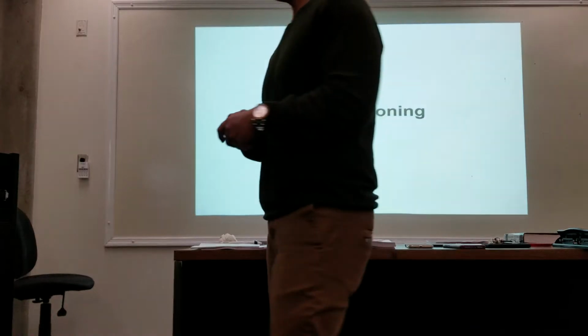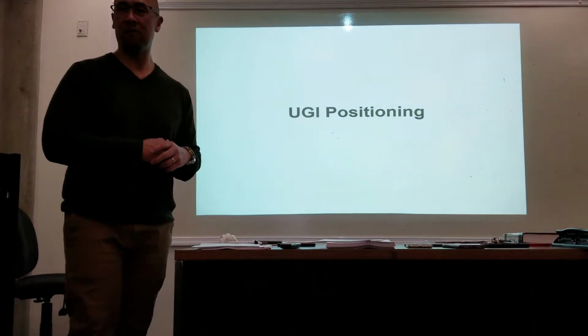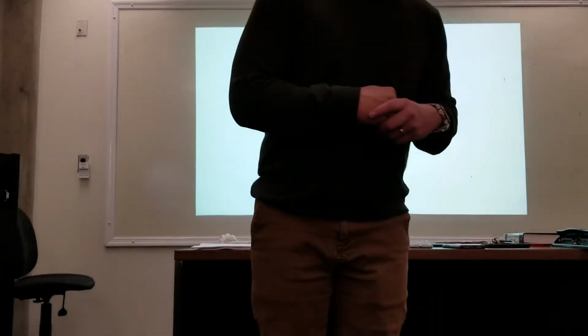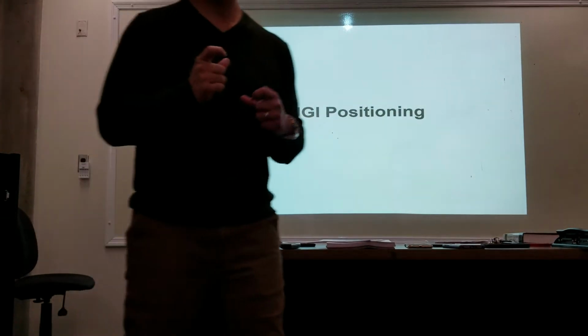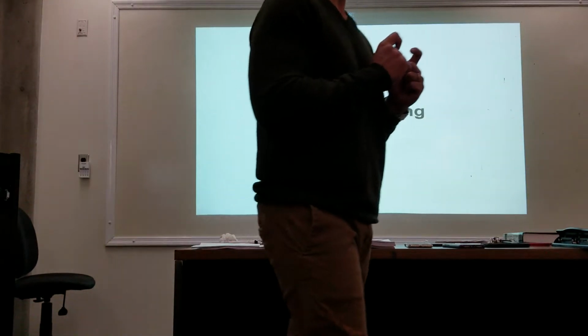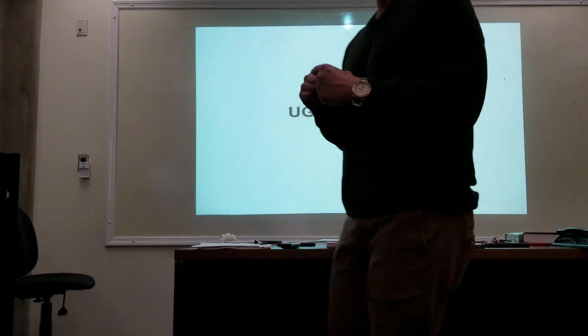Now, what you're going to do is prep the patient by giving them something to drink before the doctor comes in. So you're going to have your contrast, the barium. You're going to have your gas crystals. Because it's a double contrast study, you're going to have your barium and your gas crystals ready to go.